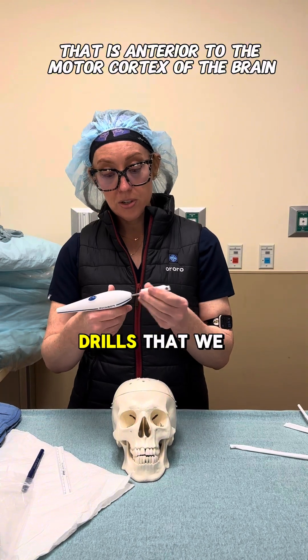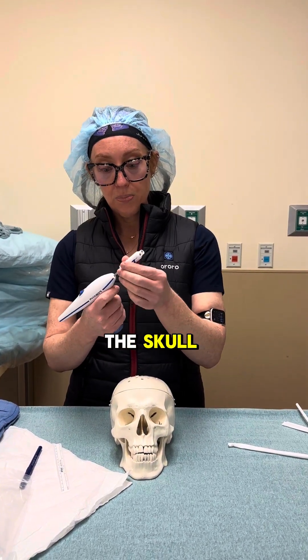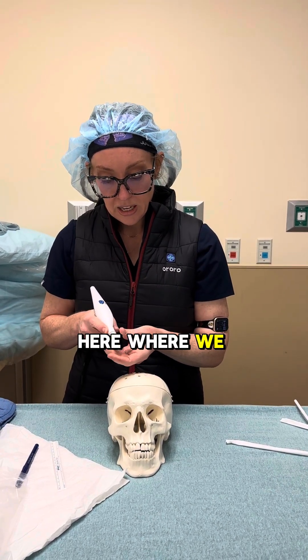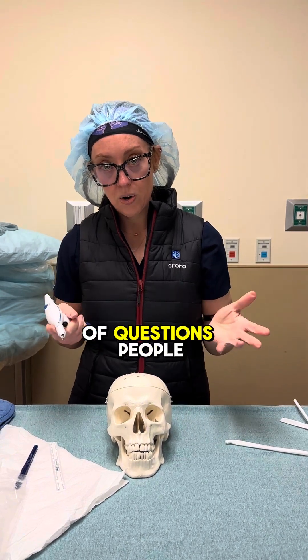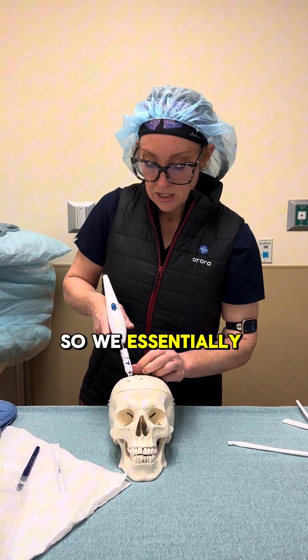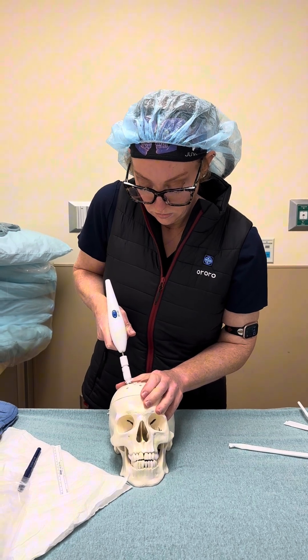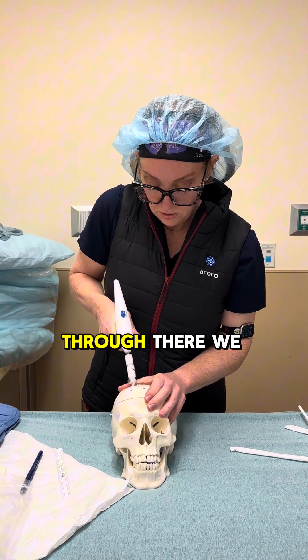We have drills we use at the bedside that allow us to make a small hole into the skull. The drill has a guard on it and a little adjustment piece that lets us change the depth, which helps prevent plunging. A common question is how do you not go into the brain — well, there's a guard on here so we can't do that. We place this on the skull and drill through.